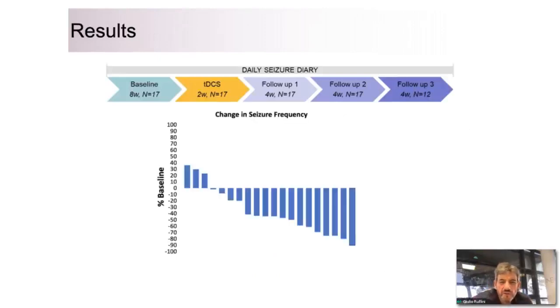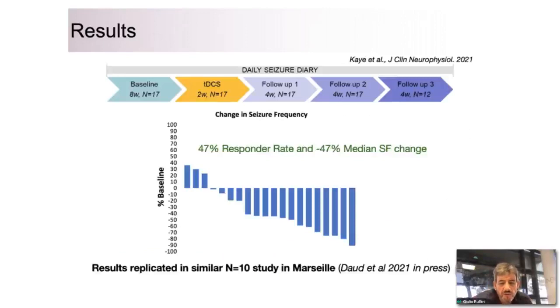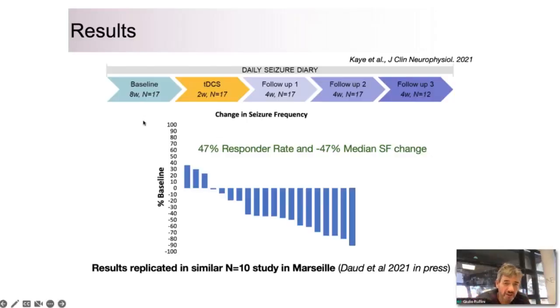We showed in a pilot study that using brain stimulation directed at a target specified by a neurologist for refractory epilepsy patients could lead to a reduction in the seizure rate in these patients. There are a couple of papers describing this now, and we are now working on a pivotal trial with this technology, with the physics technology applied to refractory focal epilepsy.